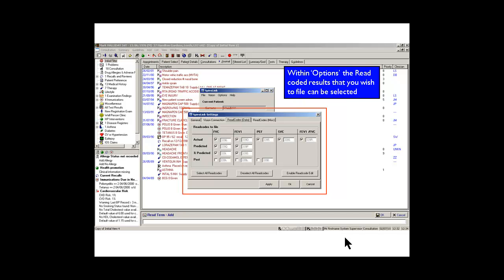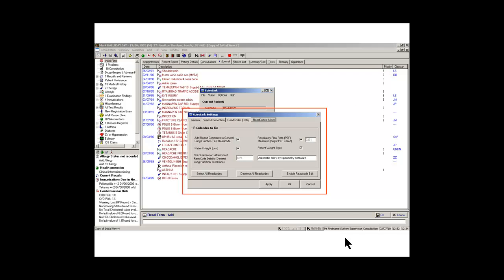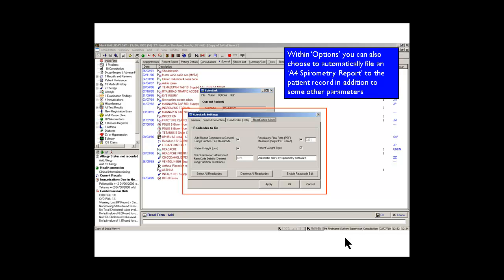Simply place ticks in the boxes of the required tests that you wish read coding. There are also a number of miscellaneous read codes including whether you want the patient height and weight putting back in, whether you want the respiratory flow rate measured. There's lots of things on here that you can do.